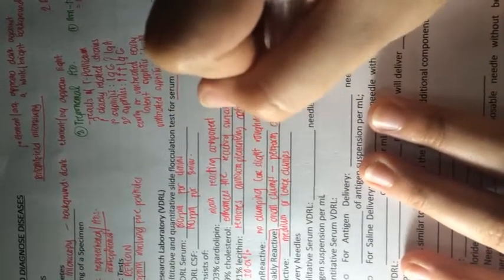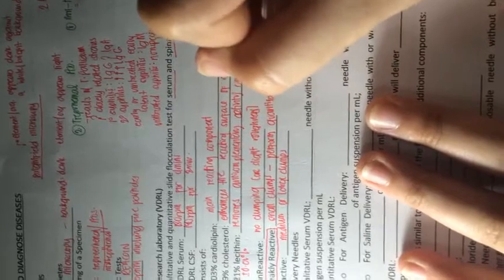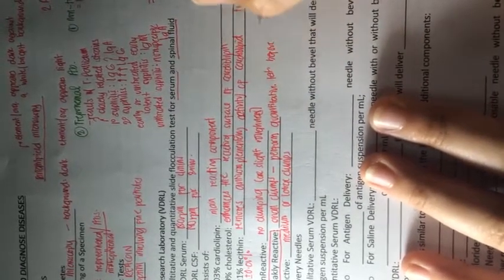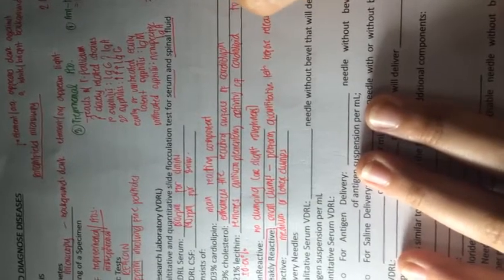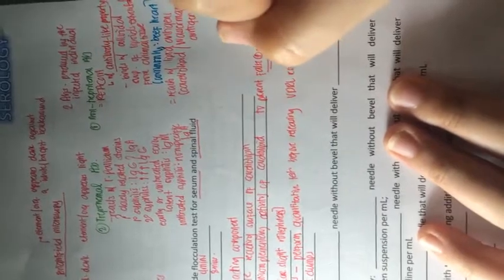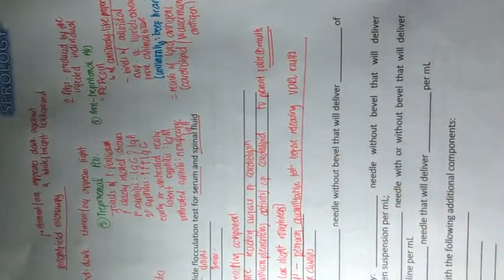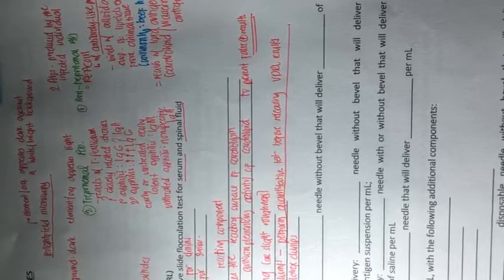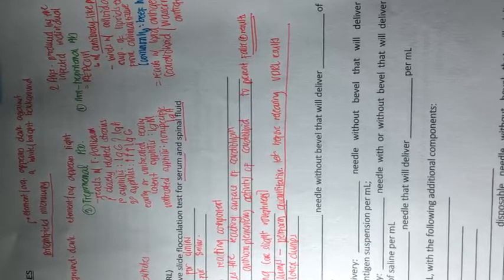For weakly reactive results, we should perform quantitative tests before releasing VDRL results. So there should be verification as to whether it is a true positive or a true negative, in this case, a true non-reactive or a true reactive result. So we should perform quantitative tests before releasing VDRL results.